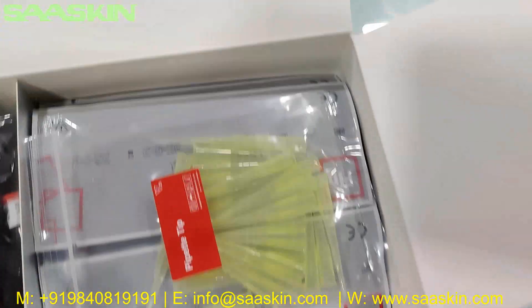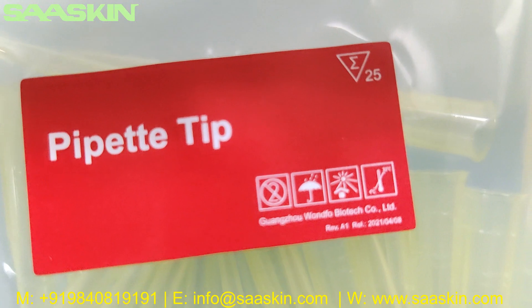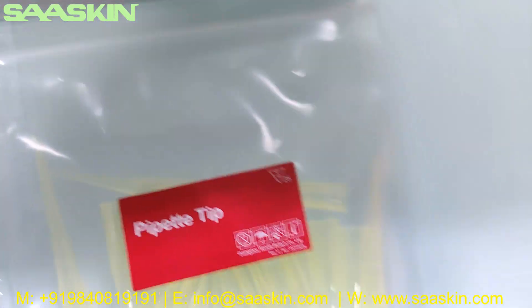Inside you can also see there are 25 paper tips. You can see there are 25 numbers of paper tips included in the kit.